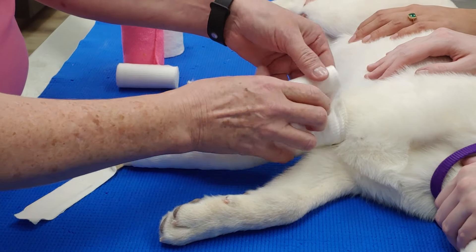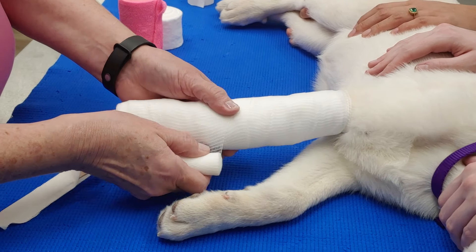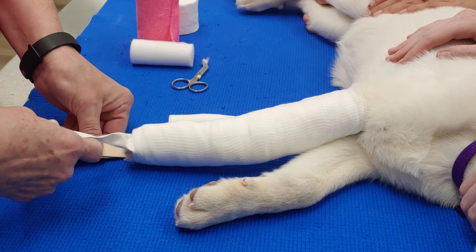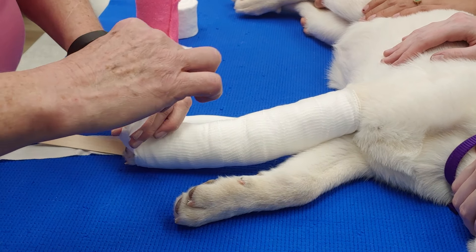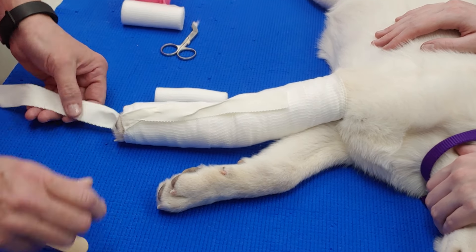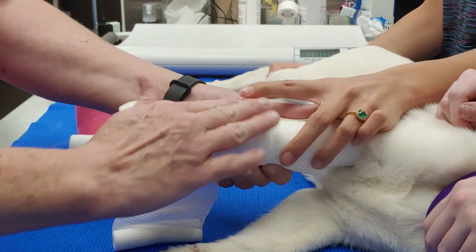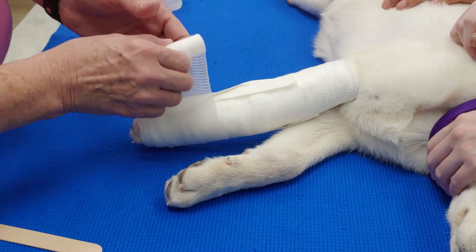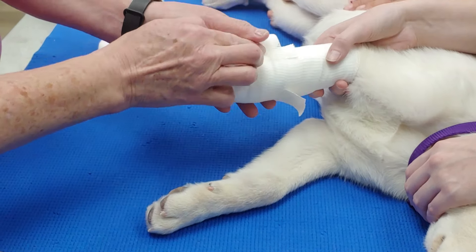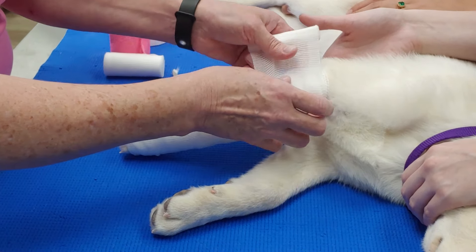Then I'm going to do one more little layer, and then this is where I put my stirrups on. I just stop, take my stirrup off, turn it around, and put it like this on the inside of the bandage so that it anchors the bandage I just put on. Then I'll just do another little roll over top — a couple layers — to keep it from shifting up and down the leg to a certain degree.